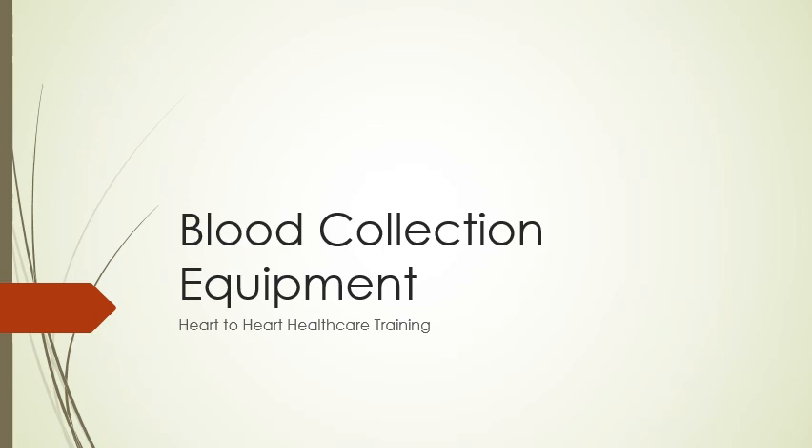Blood collection equipment. We're going to get into all the different things you need to properly collect blood, what they are, what we use them for, and things of that nature.